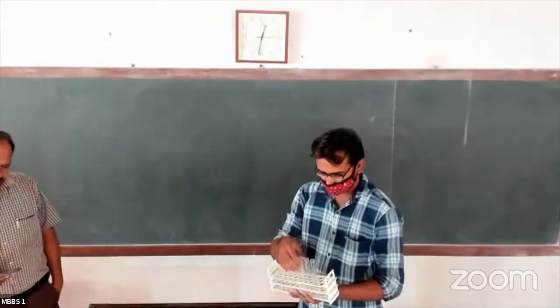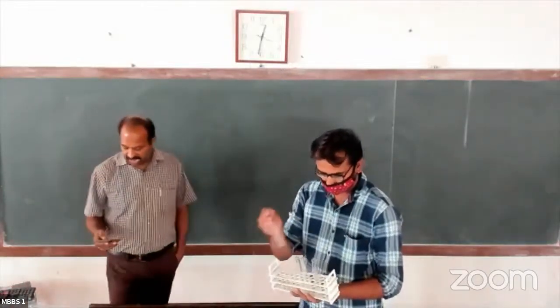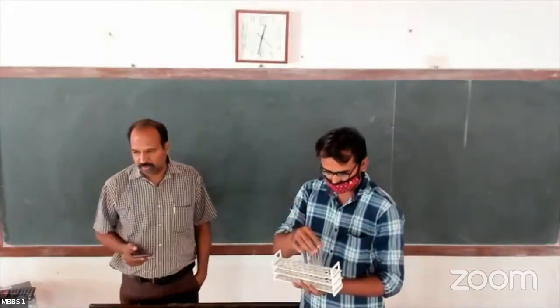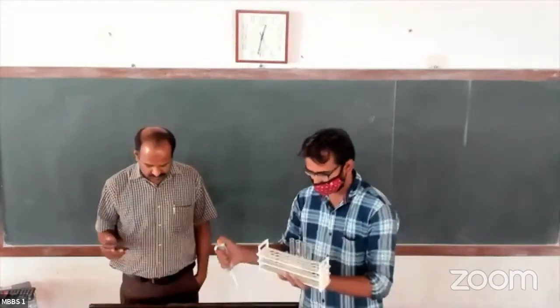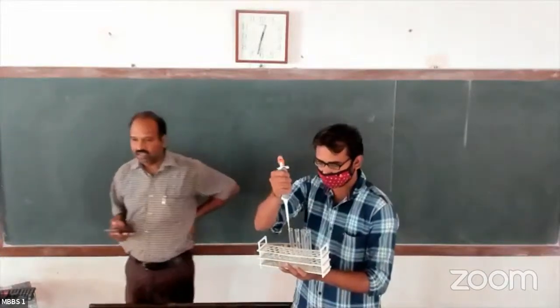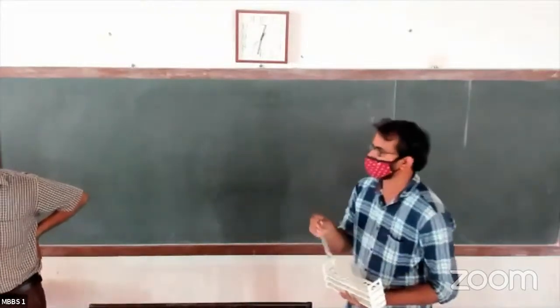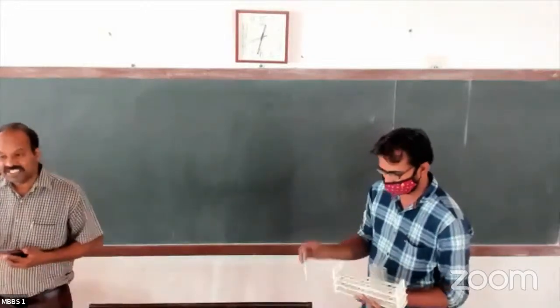Okay, will not wait, directly add the serum. Then add serum, 0.1 ml, in only the unknown tube. Then incubate 15 minutes at 37 degrees centigrade.